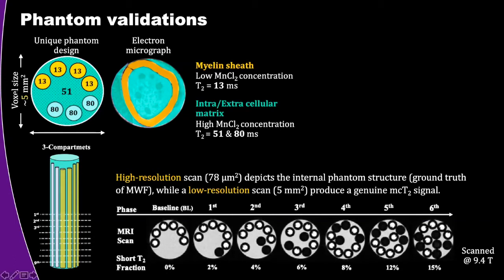It was 5 millimeters by 5 millimeters. And inside a test tube, we put capillaries that contain water that had different T2 values. In this case, 13 milliseconds and 80 milliseconds, all immersed in a water pool that had a 51 millisecond T2 value.